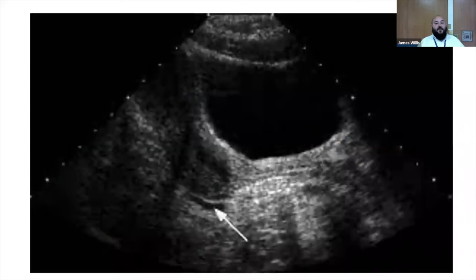Like we did with pediatrics, let's discuss a case. So you're working in CCT and you receive a trauma notification for a 27-year-old female bicyclist struck with LOC. Now she's back to baseline, currently alert and oriented. Primary survey is intact, secondary survey just noted with abrasions on her bilateral arms. Her vitals are stable. You perform an eFAST.